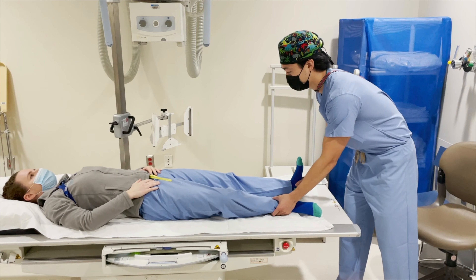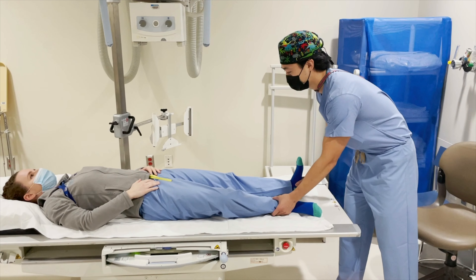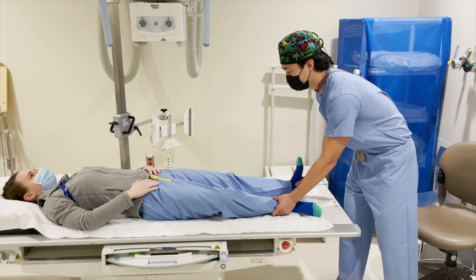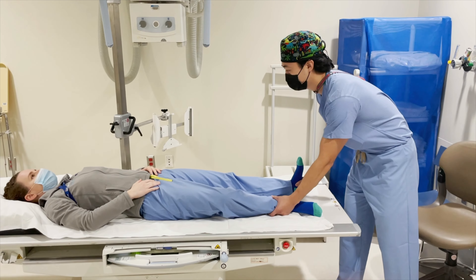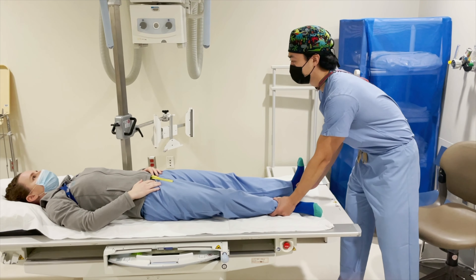The following is a video demonstration of the traction internal rotation view. The patient is positioned supine on the radiology table. One hand should be placed on both of the patient's lower extremities. The patient is instructed to hold their arms above the head or hold the table to prevent the hand from going into the view. With counter traction, the contralateral lower extremity is buttressed to prevent the patient from sliding down the table, and then the injured leg is pulled and internally rotated until the patella is facing superior. The radiology technician shoots the x-ray, and then the traction can be let up from the injured extremity.